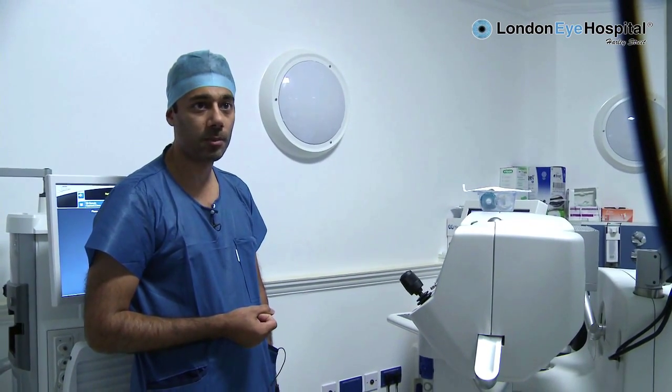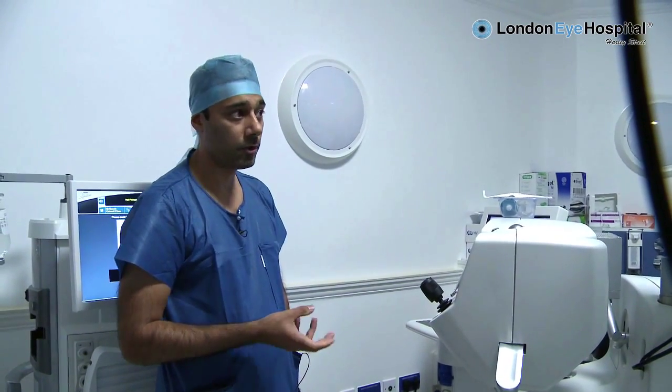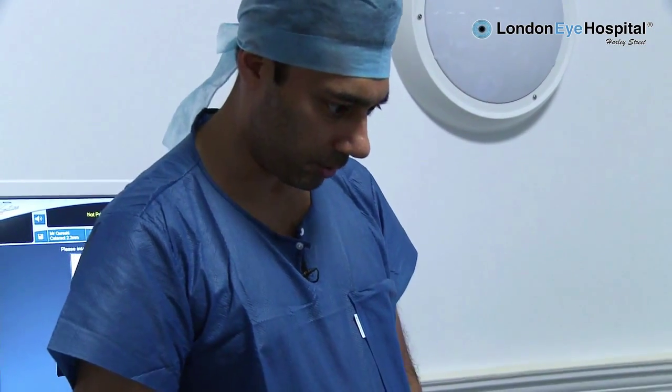So we don't need to use knives or blades, and the laser will carry out the whole procedure for us virtually. We need to have very accurate imaging of the eye, so this also incorporates an OCT scanner. This will make a three-dimensional picture of the eye close to a micron level of accuracy, which the computer will then evaluate, and we will program it to carry out the surgery specifically for this patient.